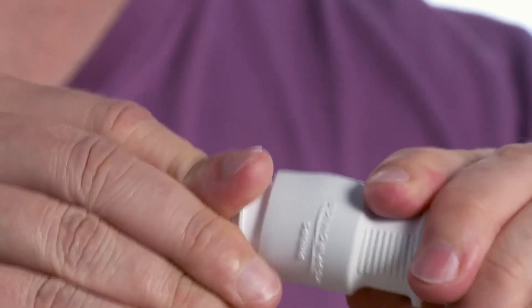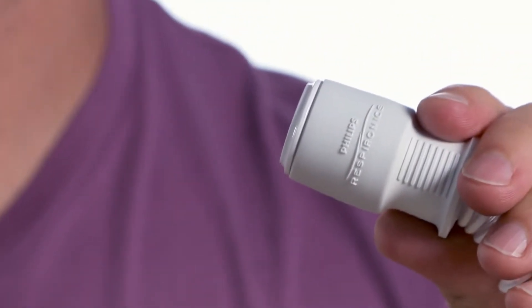Before fitting the mask, insert the tubing quick release into the tubing that came with the CPAP device.